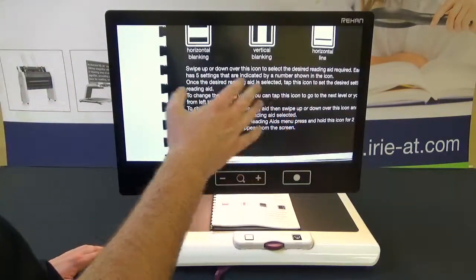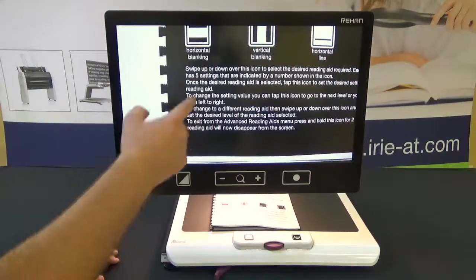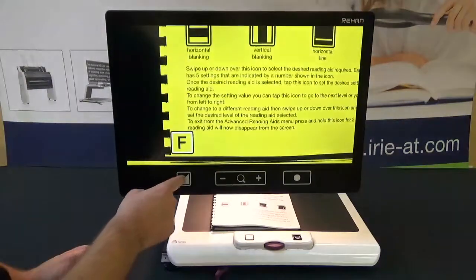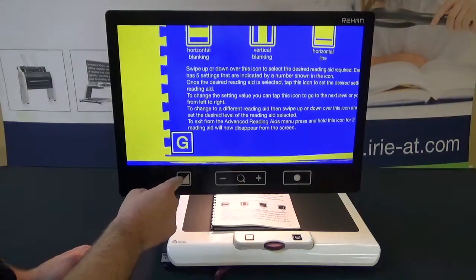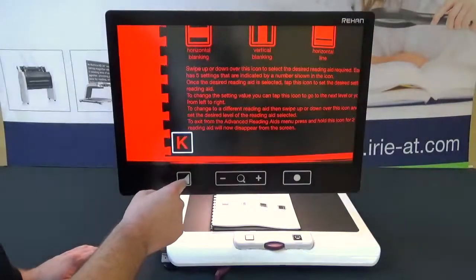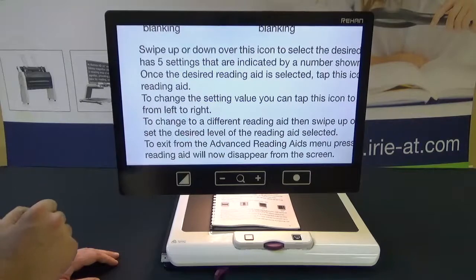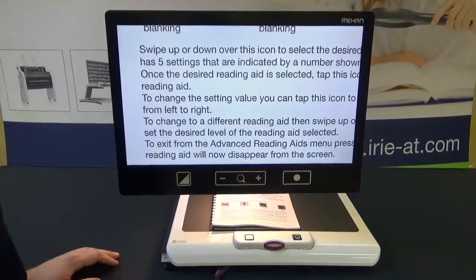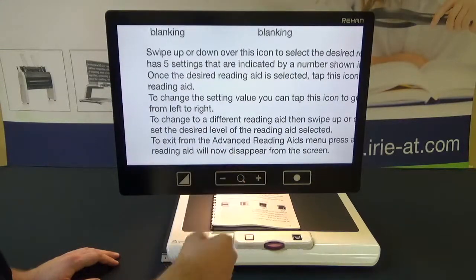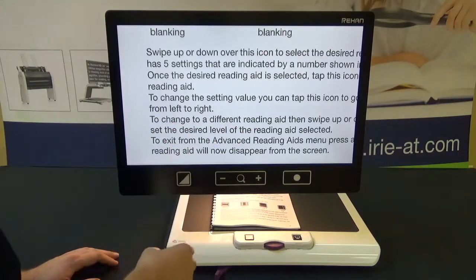When I switch from high contrast mode to full color mode it will adjust the zoom level. Continuing on: white on black, black on white, yellow on black, black on yellow, blue on yellow, green on black, black on green, red on black, black on red, and back to full color — you'll notice it zoomed in because I have a different zoom level set for full color mode. We also have plus and minus buttons for zooming in and out, which will zoom all the way up to 65 times magnification.